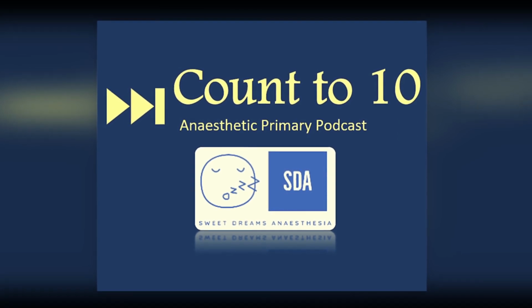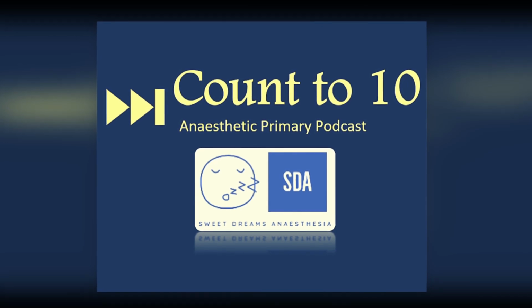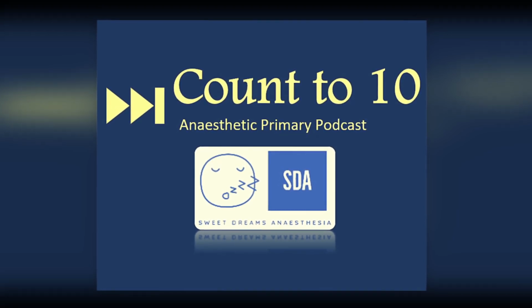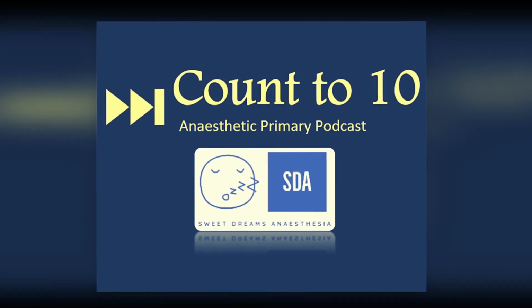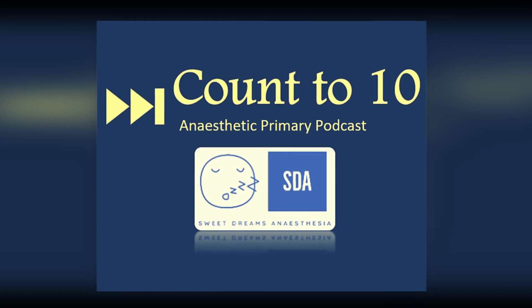At the same time, the processor takes time to display a value, and this lag time for a signal can be up to 10 to 20 seconds. The effect of this is that there's a delay between what's been measured to what's clinically happening in a patient. And this is why we say if there's an acute problem with the patient, the SATS probe might be the last thing that actually decreases in value.